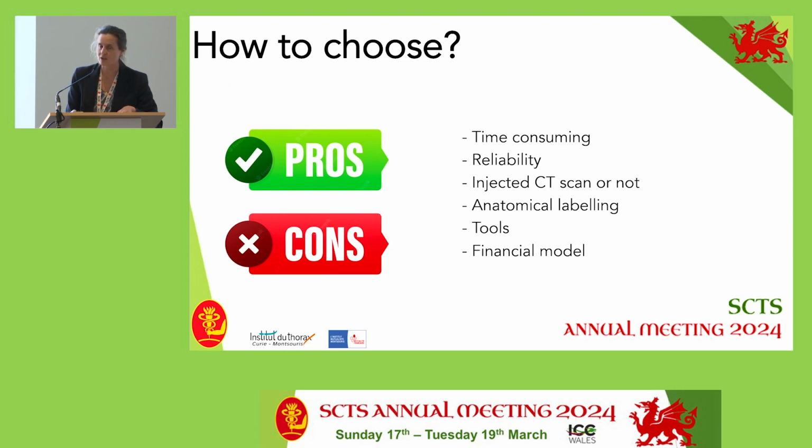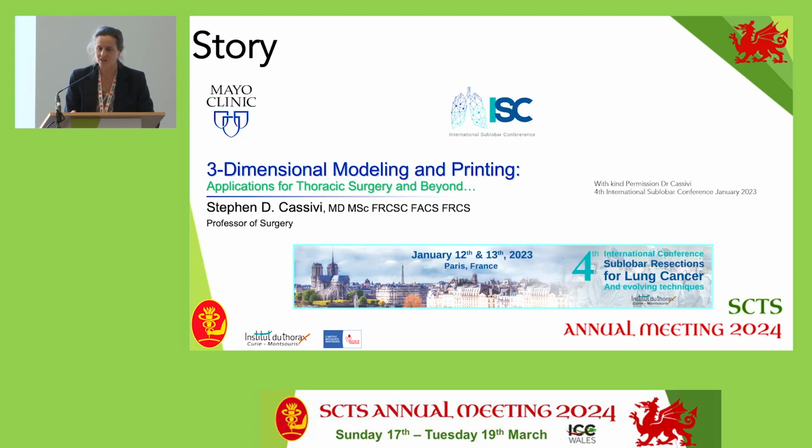For example, Visible Patient is nearly ready to release 3D models without injection, and that is a very great one. You have to think about anatomical labeling, like I said, and whether you can use the 3D models for doing something else than only seeing the anatomy of your patients, and we all know that sometimes it's also based on a financial model.